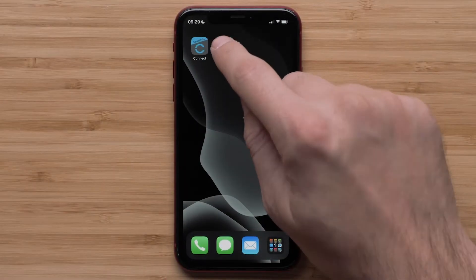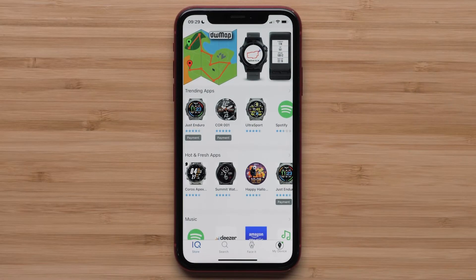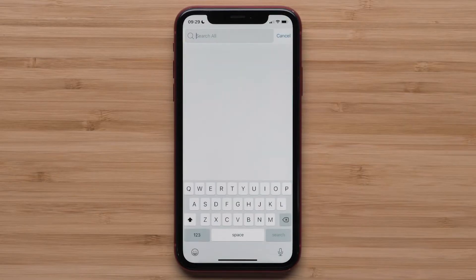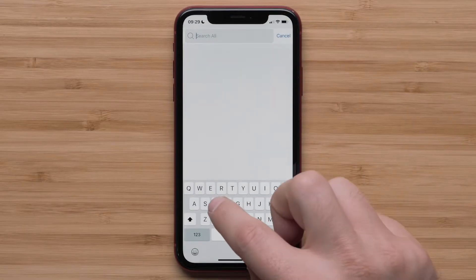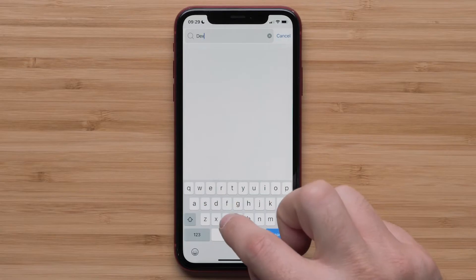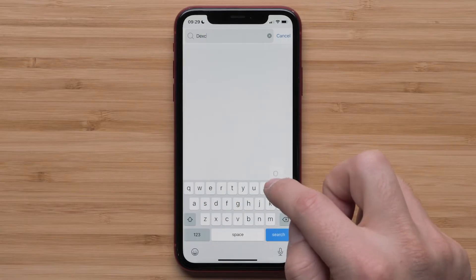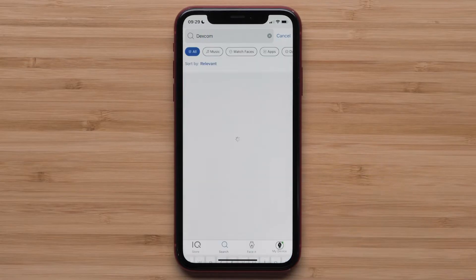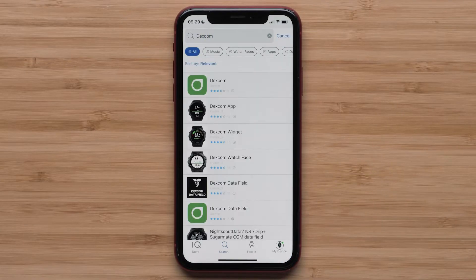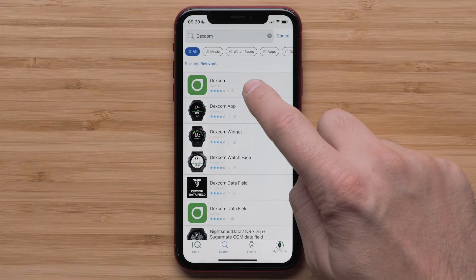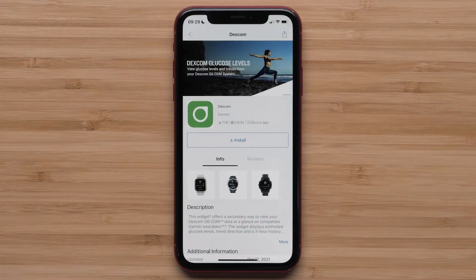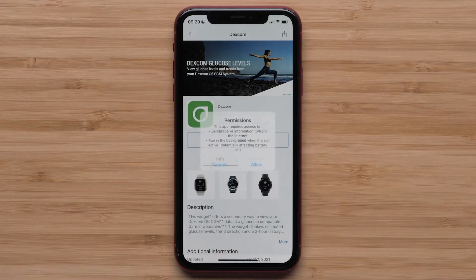Start by opening the Connect IQ app on your smartphone and search for Dexcom. Then select the Dexcom widget, touch Install, then agree to the app permissions to continue.